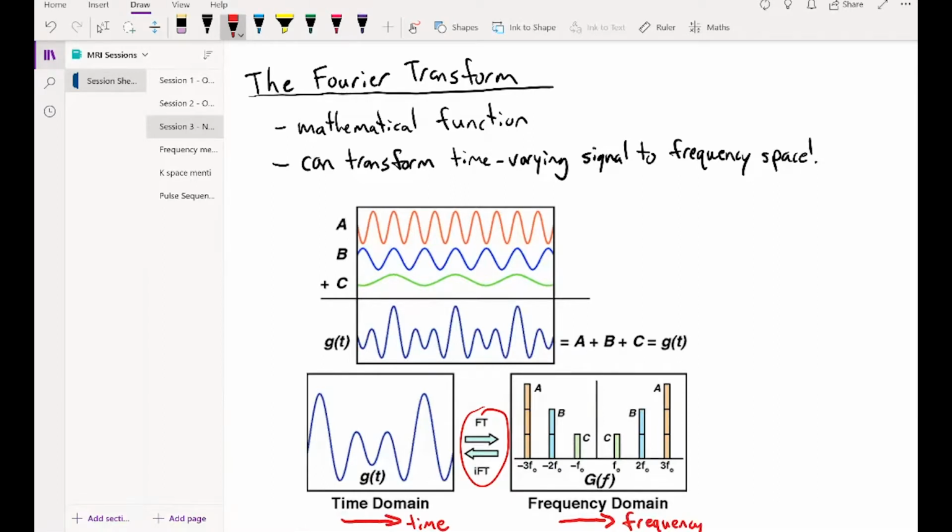What we're looking at is the signal that we've recorded across time, the whole thing, and we're breaking it down into the signals at various frequencies that are composing that one function that we put into the Fourier transform. And you can see those above. I've skipped over this, but that's these three signals, A, B, and C, up here. They're getting added together to create that function at the bottom that we have put into the Fourier transform. And these get separated and teased apart into the frequency domain using the Fourier transform, and they're represented like this down at the bottom in the frequency domain.